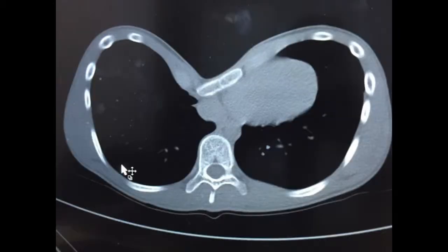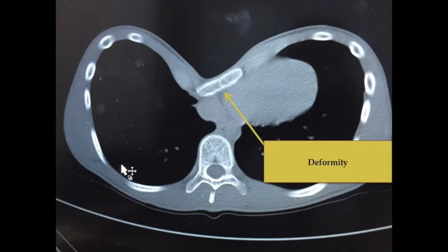This is the transverse view of the CT scan. It was a case of a 19-year-old male. The CT scan was performed and it was diagnosed as pectus excavatum, also known as funnel chest. Here you can see the deformity, which is labeled.